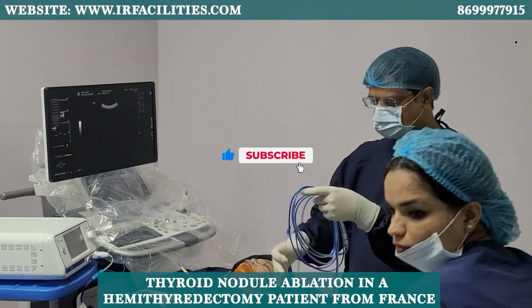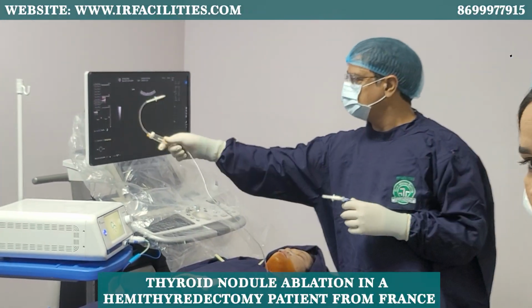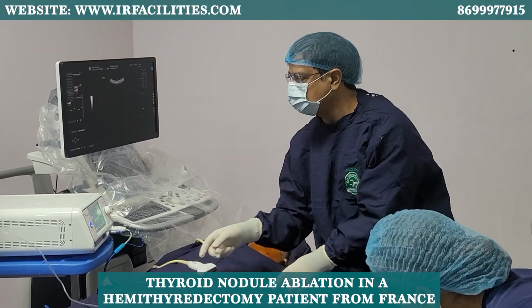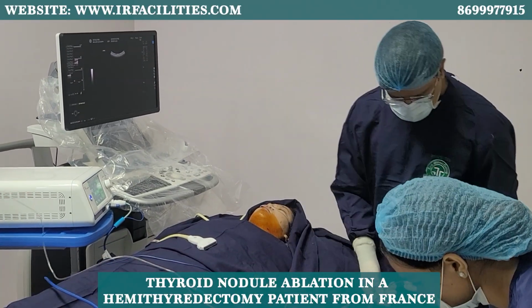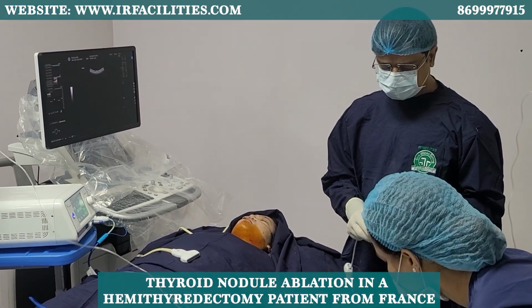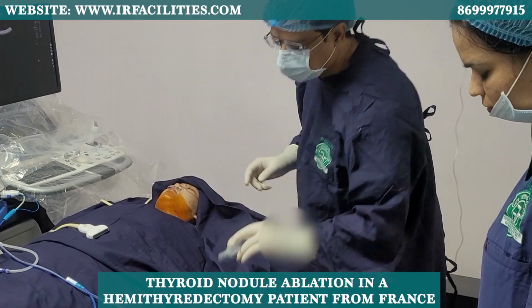So we gave her some anxiolytic so that she's not anxious during the procedure. This is a cool tipped microwave. So this is how I do the cooling. This is for the fluid tip method also, and these both are for this work. She's not anxious, she's sleeping now. We've given her a little fentanyl and her saturation looks okay.